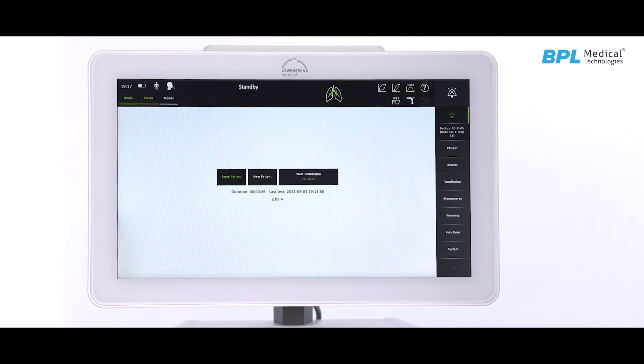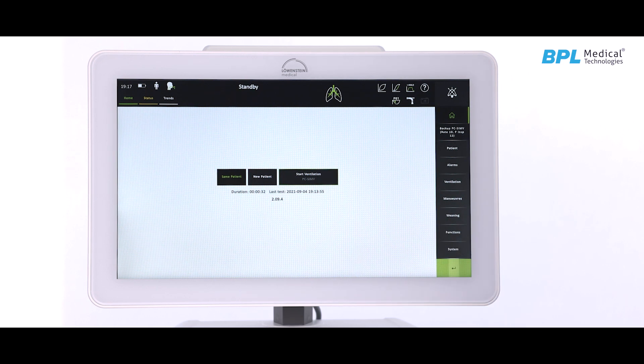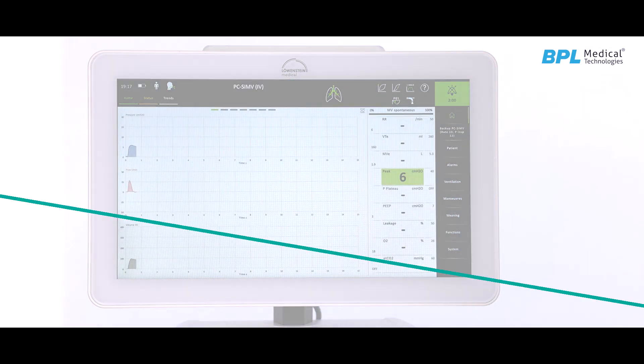If no input is given, ventilation can be started with the default setting. Press the start button and enter to initialize the ventilation.